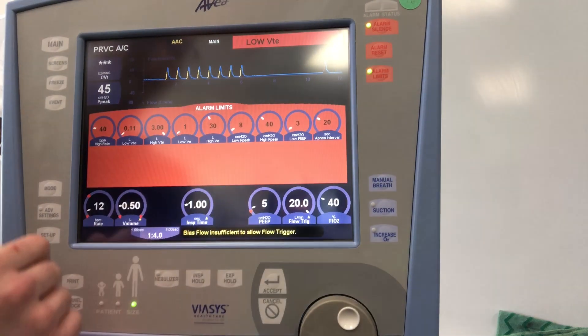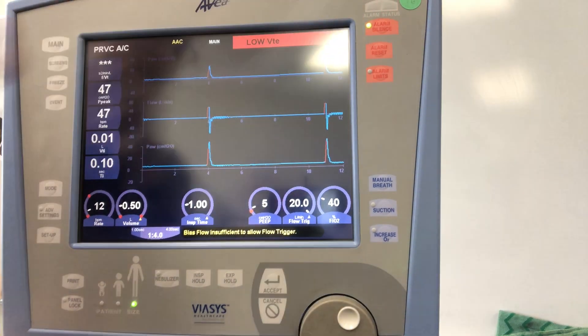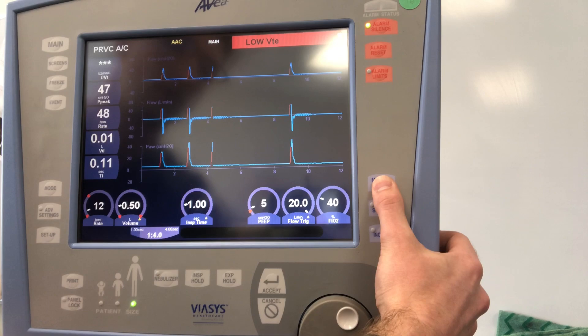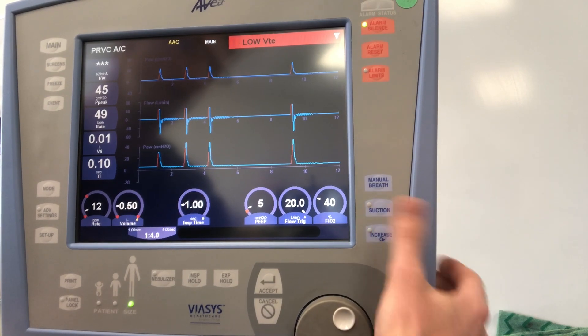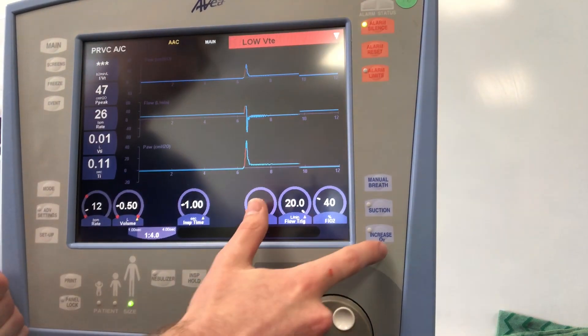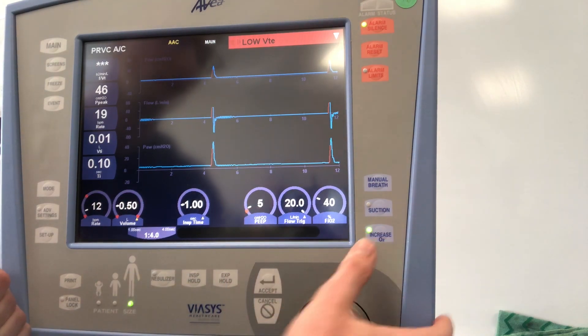Alarm reset and alarm silencer are here — this will silence alarms for two minutes. We can give manual breaths on the Avea. We can also hit Suction, which — similar to the Draeger V500 — increases FiO2 by 79% above your set FiO2 as a default, for two minutes, and cancels any alarms that show up. Instead of hitting suction, you can also just increase your oxygen concentration directly. You can go in and modify that percentage if it's too high for your patient.